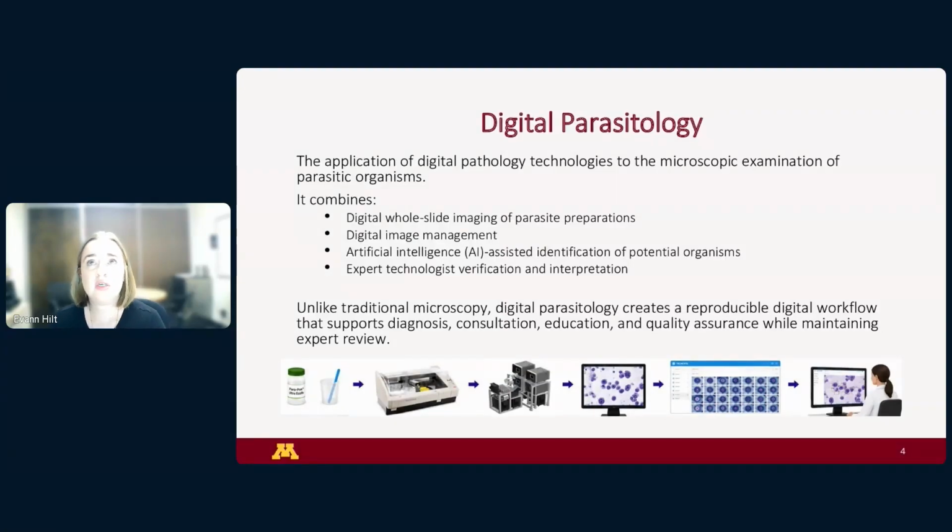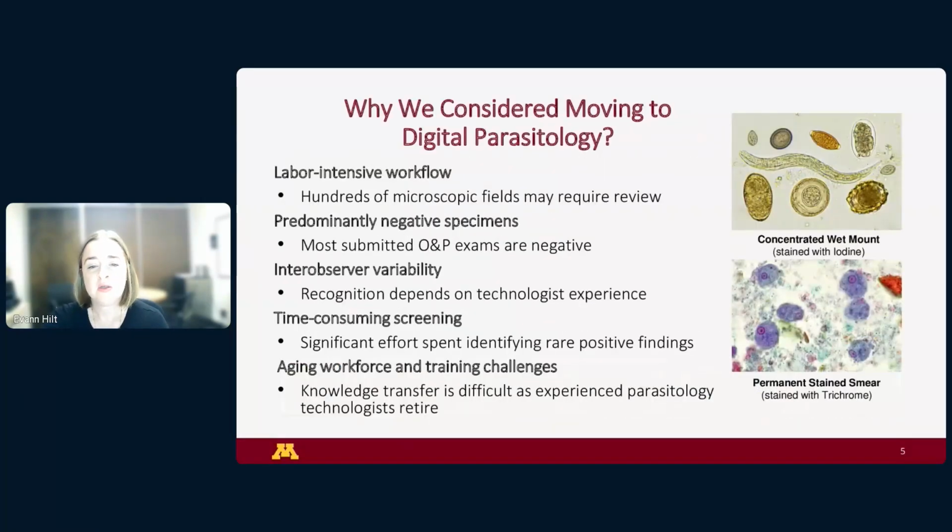So unlike our traditional microscopic workflow, this creates reproducible digital images that can support the diagnosis, any consultation, education, and quality assurance, while also maintaining our technologists as the experts in reviewing it. So why did we consider moving to digital parasitology? There were several factors here.